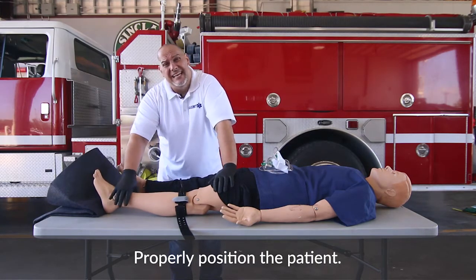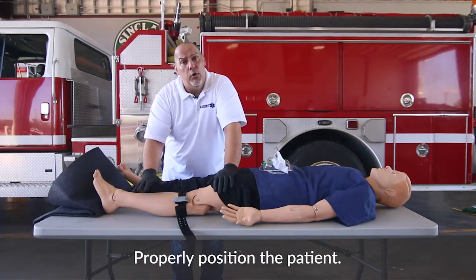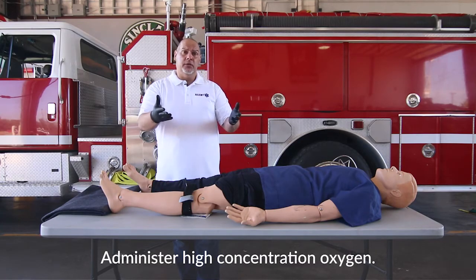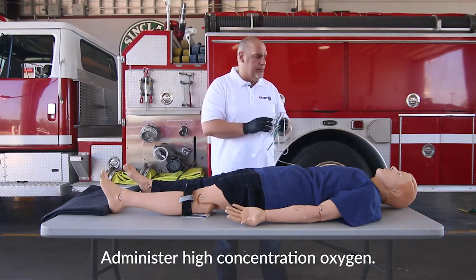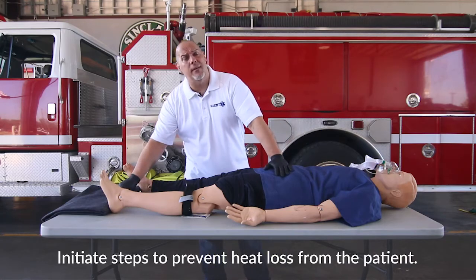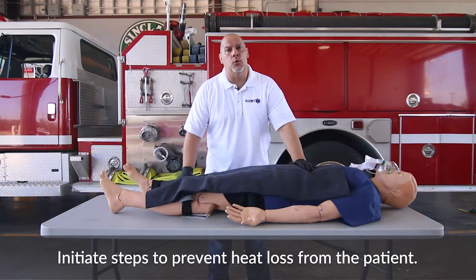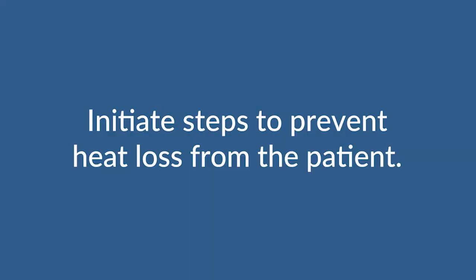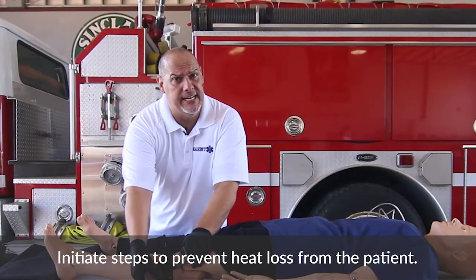One of the things you need to think about now is: is the patient in the right position? Do you need to put them on a backboard? Do you need to get somebody to help you lift them to the stretcher? How are you going to move this patient to the ambulance? Next, put this person on a high concentration of oxygen — that comes at 10 to 15 liters per minute using the non-rebreather mask. Also, the patient may be losing temperature, so we want to maintain the patient's temperature, cover them up, get them off the scene as quickly as practical, and get them to a trauma surgeon as fast as you can. You need to start thinking about a transport decision, because what this person needs is a trauma surgeon.